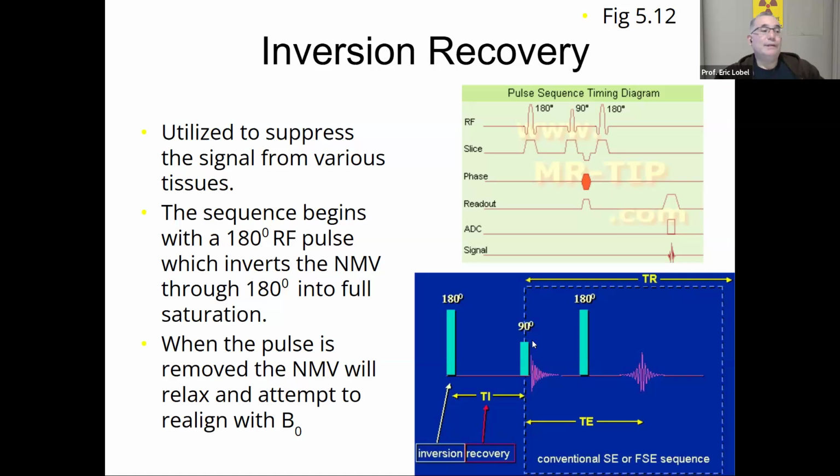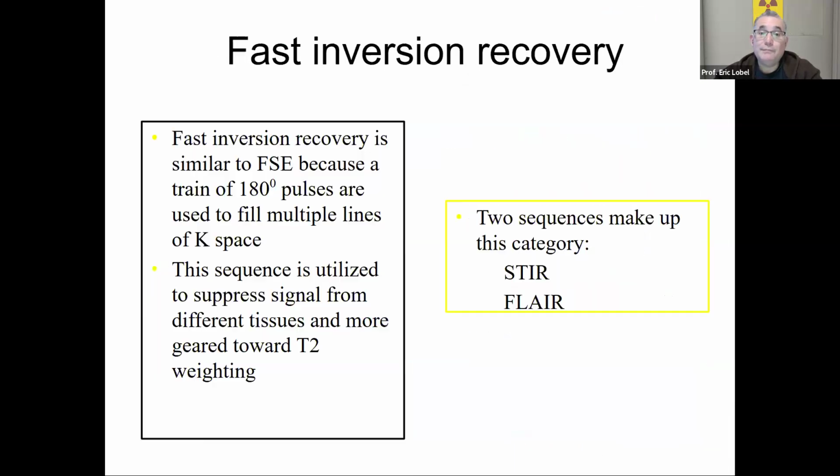That would be a double or a triple prep, it's called. So your sequence would start at the same time, but different tissues would not be getting to the surface of that pool in my story.